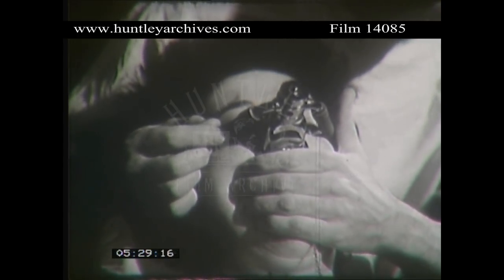Never attempt to prevent the patient breathing through the mouth with a heavy hand occluding the airway. Relaxation of the limbs is an unreliable sign. If tested before fully anaesthetized, the patient may struggle. And if anaesthetized, the muscular tone may hold the arm in the position in which you put it. Nor is the presence of dilated pupils and a squint an infallible guide.